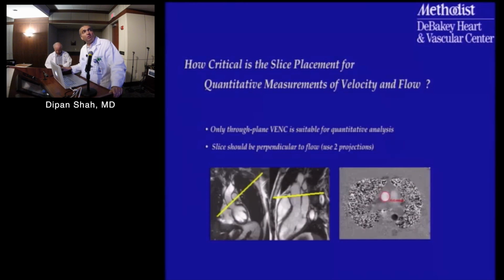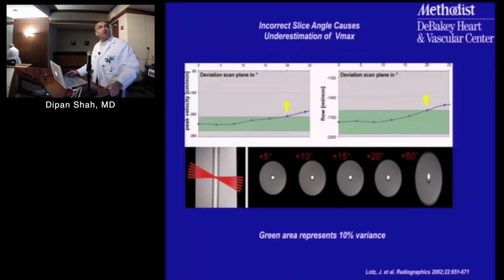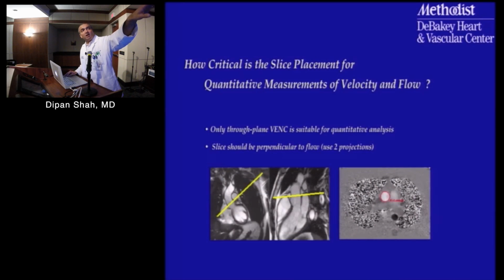Now, if I wanted to assess flow, let's say in the aorta, I would place an imaging slice above the aortic valve, as shown here. You want to make sure that you're as perpendicular to the vessel of interest as possible, so ideally you line it up off of two orthogonal planes. I've got two orthogonal planes that I'm using to line up a plane that's perpendicular to the aortic root here. And then when I run that phase contrast CMR technique, I'll get an image, which then I can draw a region of interest.